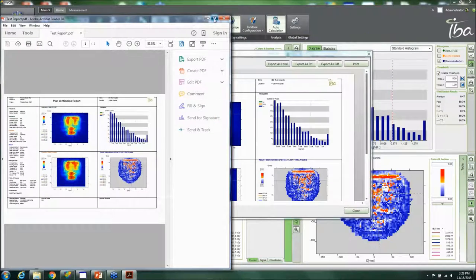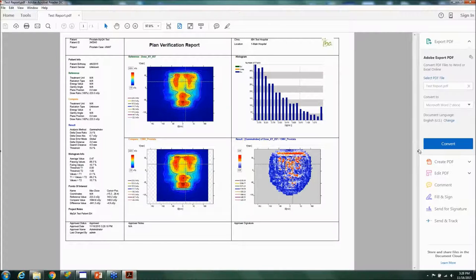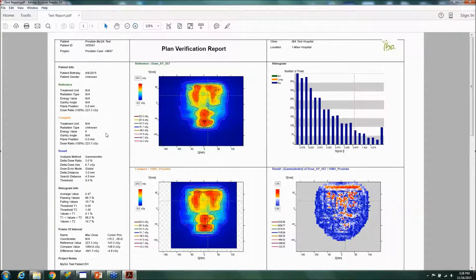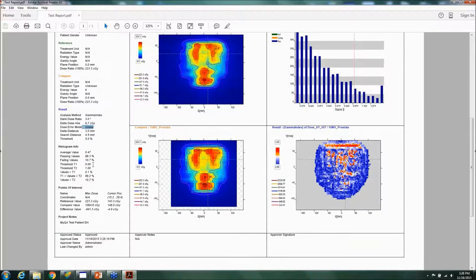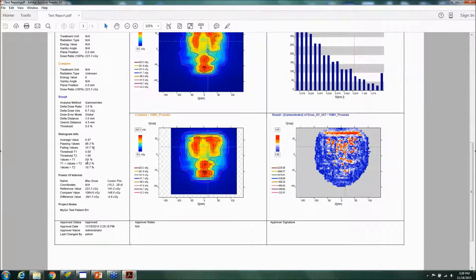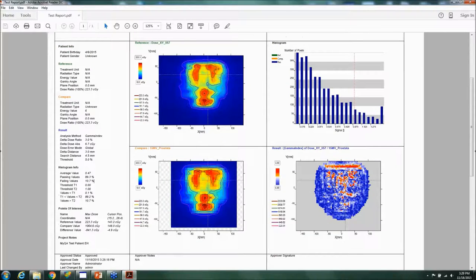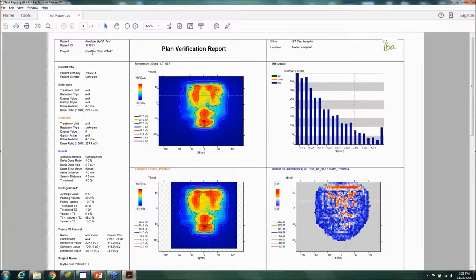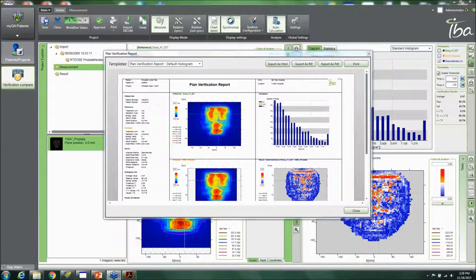Opening the exported PDF, you can see the results including the dose at CAX — using specific coordinates such as zero, zero — the differences, passing rates, histogram, result summary, a gamma index map, and the patient's name and ID. This report can then be imported into ARIA, Mosaic, or whatever other OIS you might have.